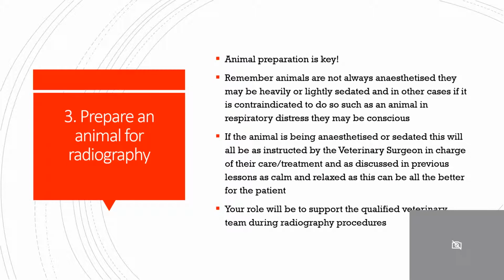Prepare the animal for radiography. Animal preparation is key. Remember, animals are not always anaesthetised. They may be heavily or lightly sedated, and in other cases, if it is contraindicated to do so, such as an animal in respiratory distress, they may be conscious. If the animal is being anaesthetised or sedated, this will all be as instructed by the veterinary surgeon in charge of their care or treatment, and as discussed in previous lessons, as calm and relaxed as this can all be, the better for the patient. Your role will be to support the qualified veterinary team during radiography exposures.